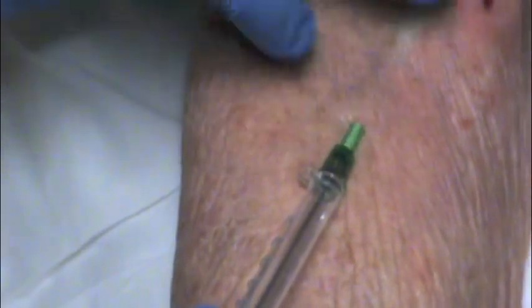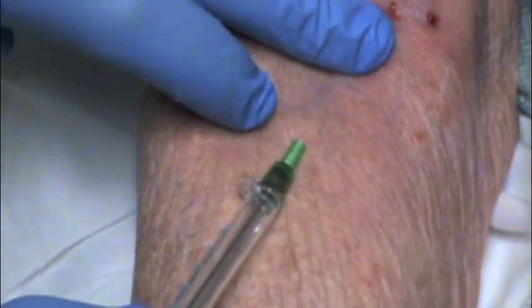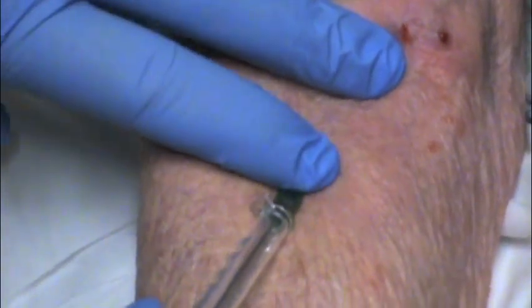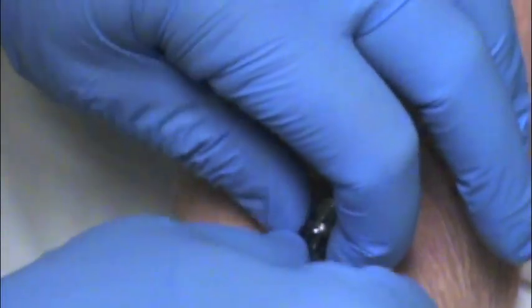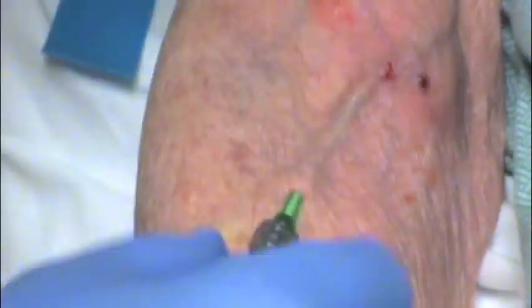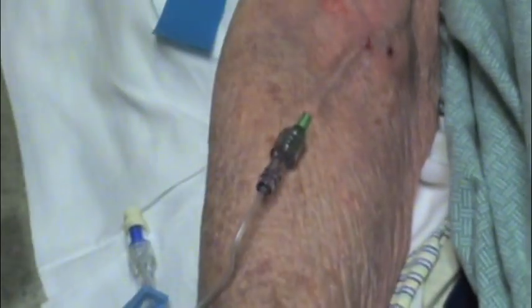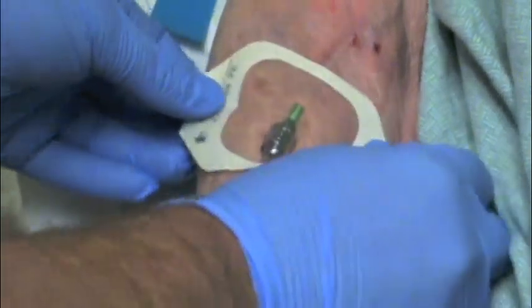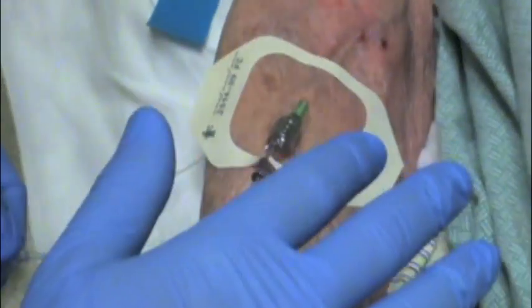There's a lot of pressure out here. This catheter is one inch long, so go one inch out from the hub and you can feel the end of that catheter in the vessel almost always. Press, put some good pressure there, and occlude the end of that catheter as you pull the needle out — otherwise you're going to have a lot of bleeding from the hub. You can put some 4x4 gauze pads underneath the hub so that if it does bleed you're keeping from making a mess. Most of the time in the ER this hep lock is not flushed yet, but most other places it would already be flushed, and you'd just flush it again to make sure the IV is good.